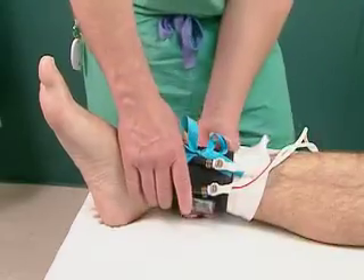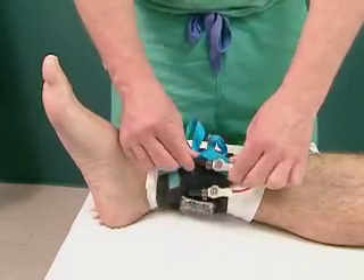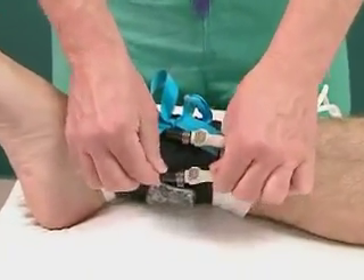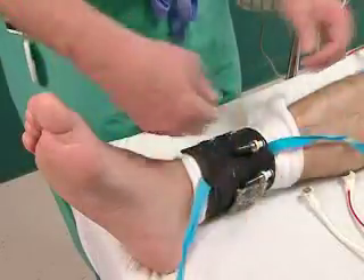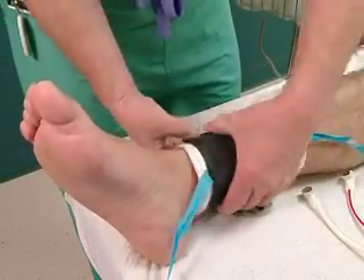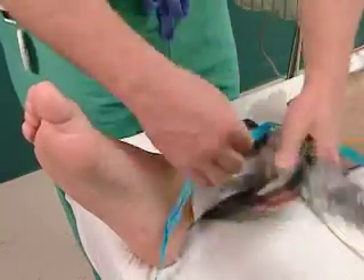If the patient experiences uncontrolled bleeding at the site, increasing the pressure may not be effective if the cuff is not allowing the pressure to be applied properly. Before increasing the pressure, check the cuff to be sure that it's inflated properly, isn't damaged, and doesn't have wrinkles or crinkling. If the location or position of the cuff needs to be adjusted, remove the cuff and reapply it.